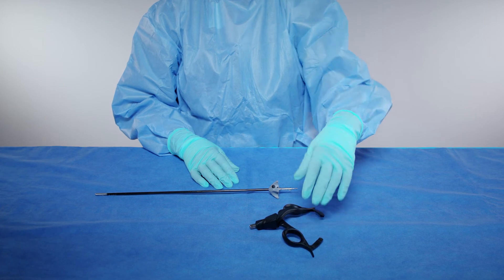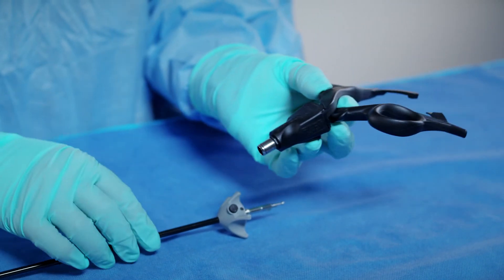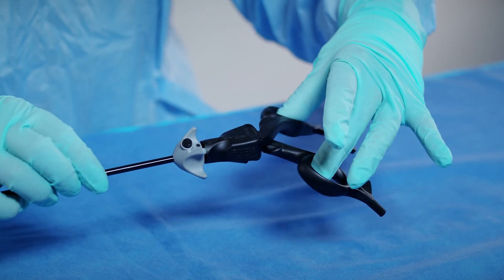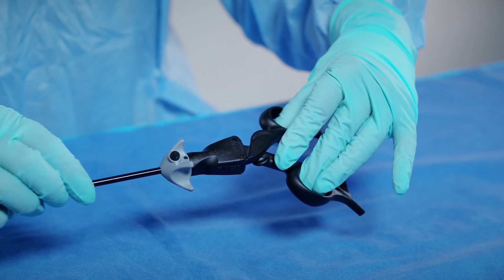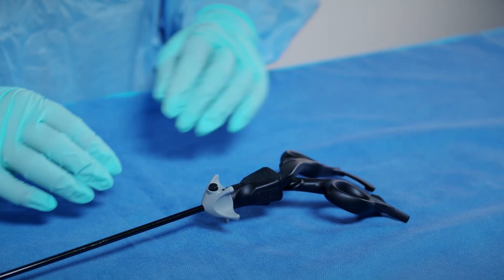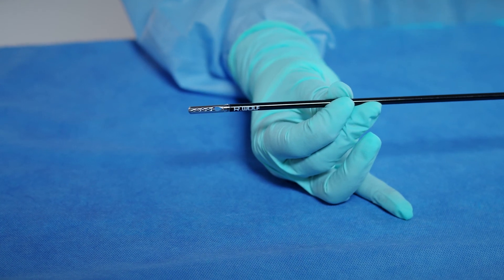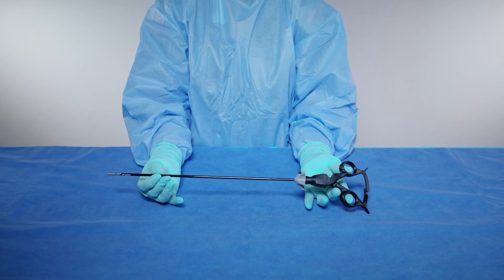Open the handle fully. Keeping the handle open, insert the sheath tube into the handle as far as it will go. While holding the sheath tube in place, begin closing the handle. The sheath tube should then automatically click into place. Only a slight effort will be required if the instrument is assembled correctly. Confirm successful assembly of the instrument by opening and closing the handle. The jaw tips should open and close in response. You have now successfully assembled the instrument.